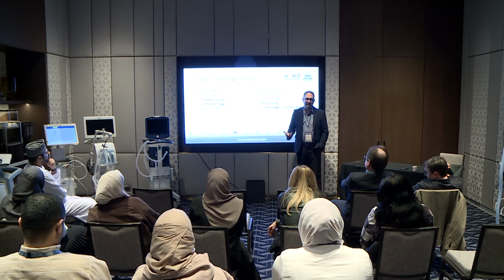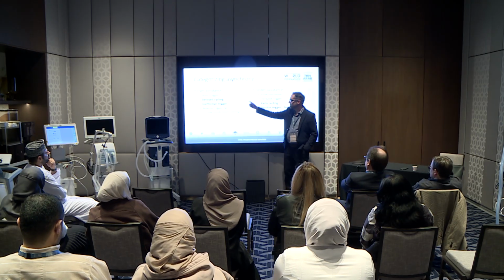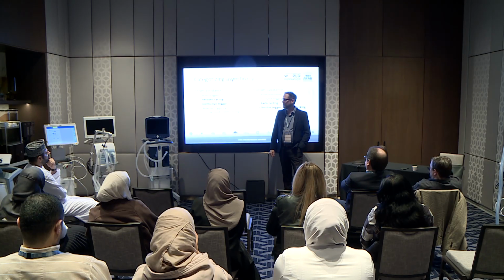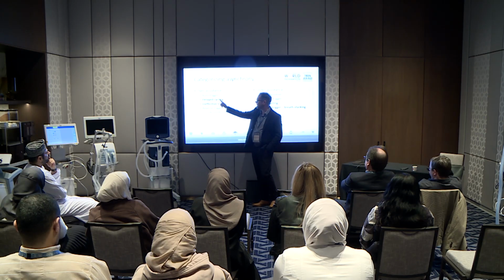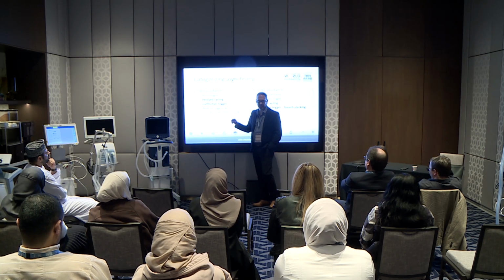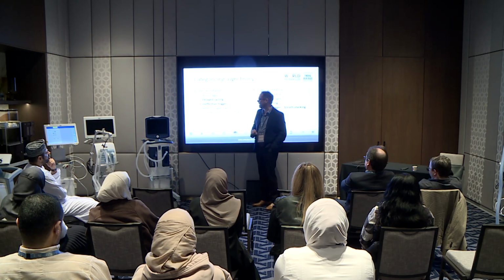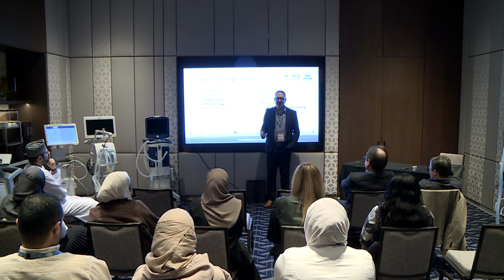So if I have ineffective efforts, okay, what's causing it? Most likely over assistance. Okay, so ineffective trigger or ineffective effort is here. Delayed cycling, I bolded these because this is the number one cause of this. It's not a trigger sensitivity, it's delayed cycling. I'll show you a nice picture that's coming up soon. Auto trigger, you're over assisting because you're giving breaths that the patient doesn't want.